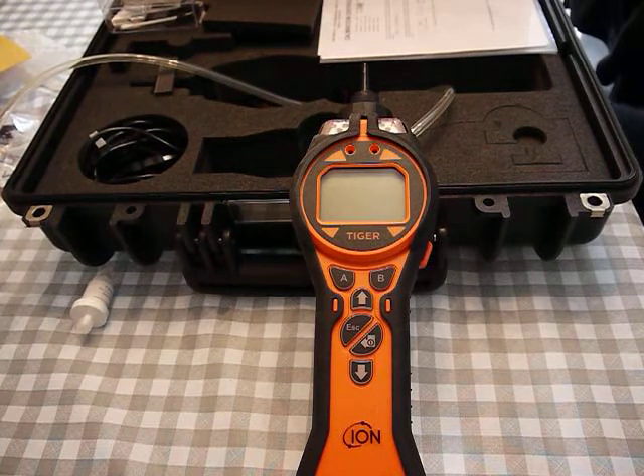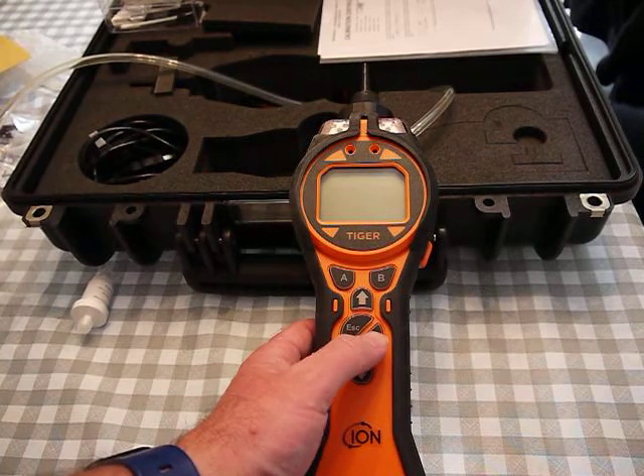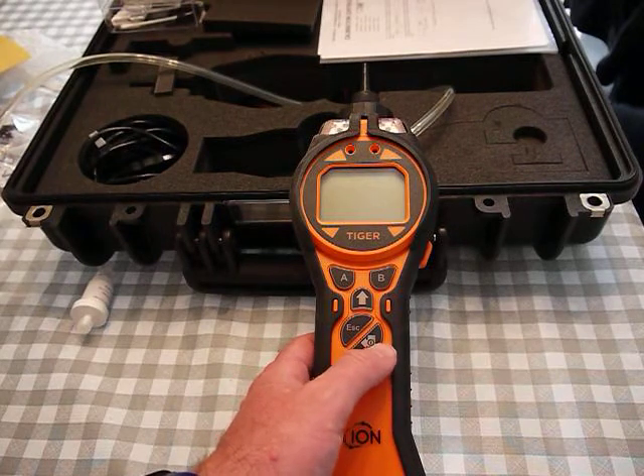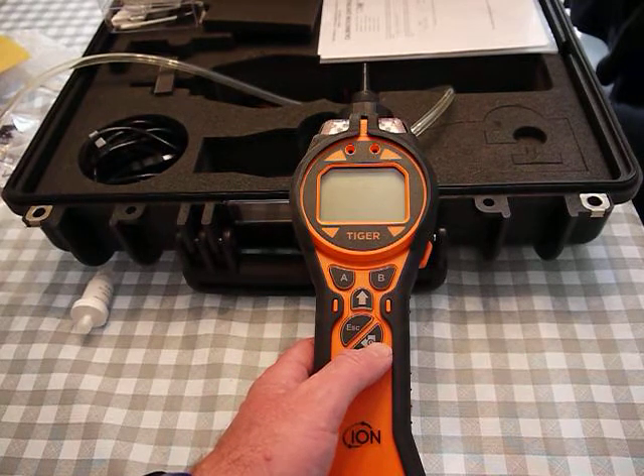This video is on the IonScience Tiger PID. I'm quickly going to go through how to bump test, check, and calibrate the meter. The on/off button is this button here with the arrow and little line through the circle.